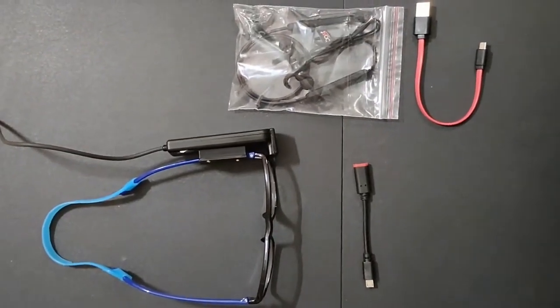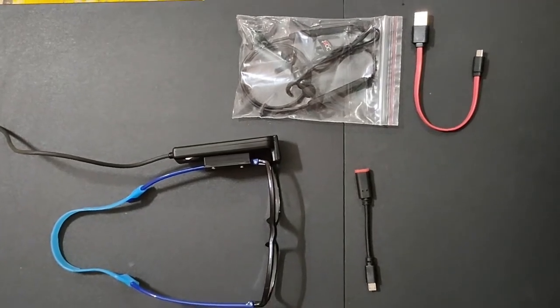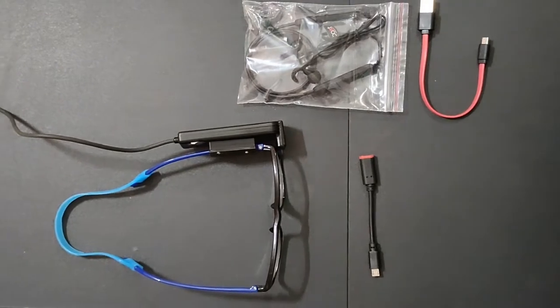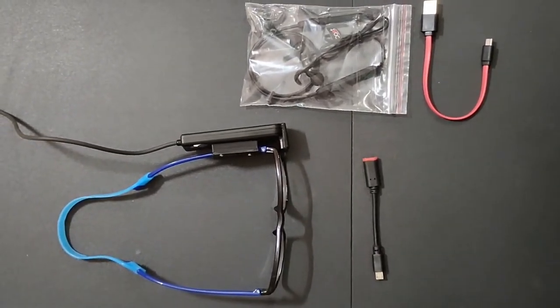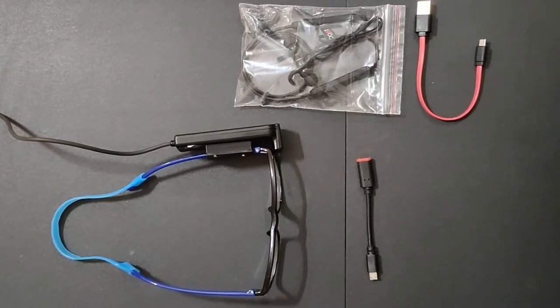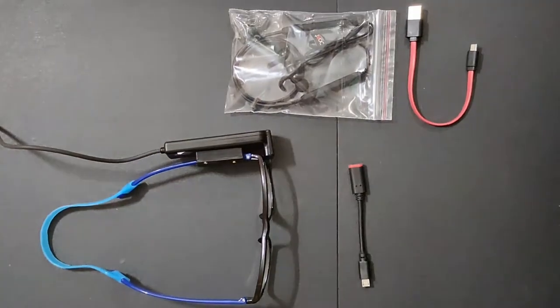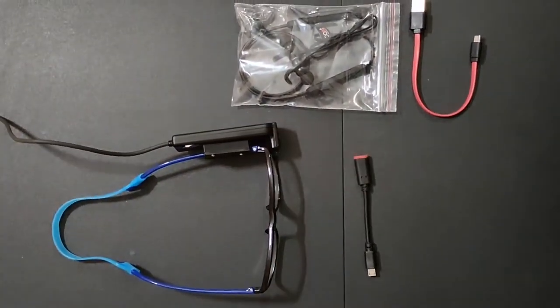Hello everyone, today I am going to share with you a video on how to use smart vision glasses. These glasses are useful for a low vision person as well as someone who is totally blind. We can also advise these glasses to one who is having partial sight or reduced field of vision.